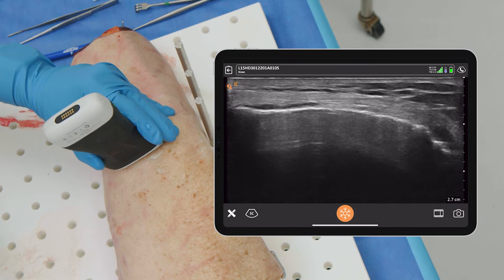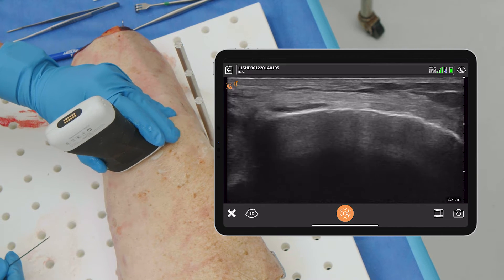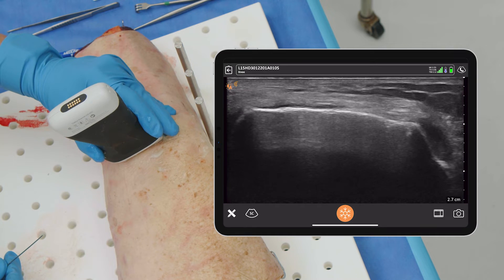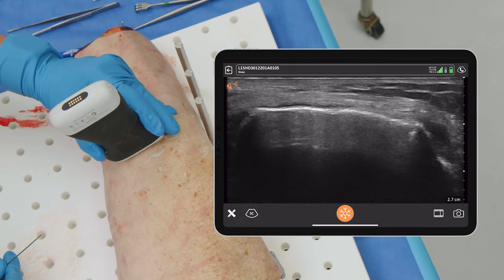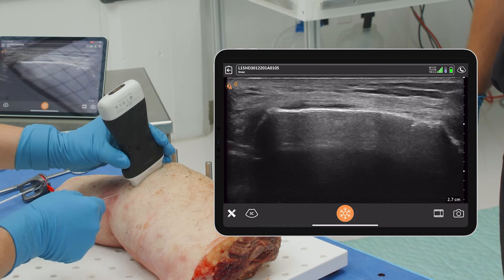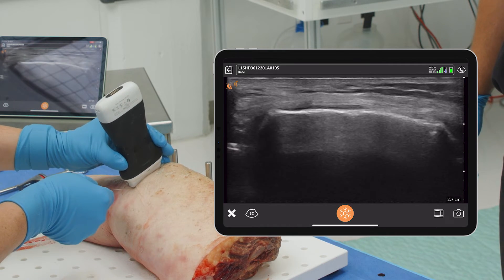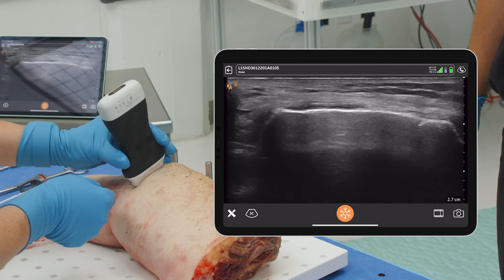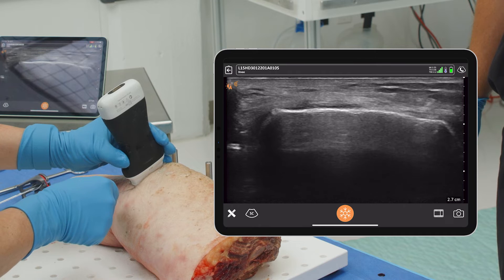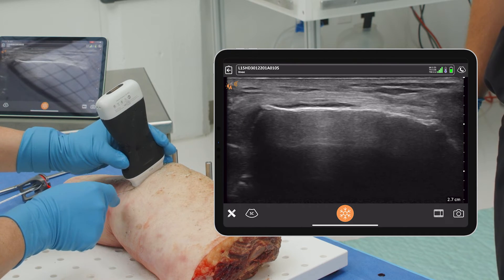The next step is to go ahead and place a spinal needle right on the location point where we want to make our anchor point. The adductor tubercle is right there, slightly proximal. We're going to go ahead and place a spinal needle right into position, making sure we can see it well — and there's the needle.